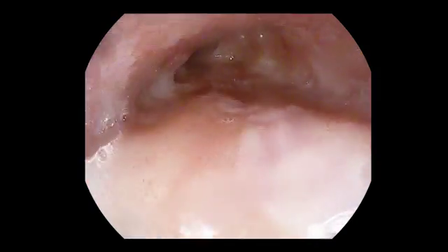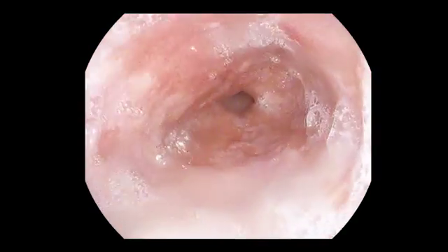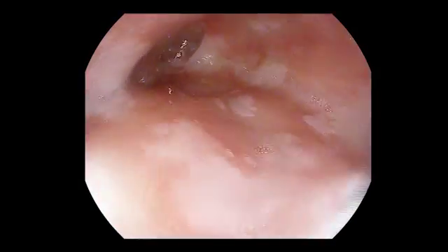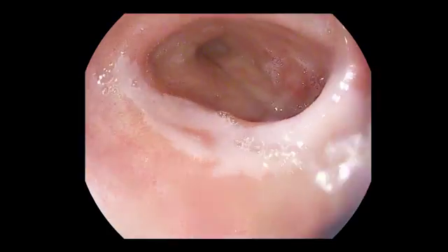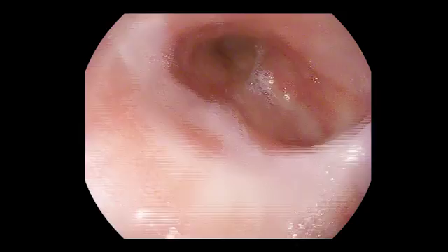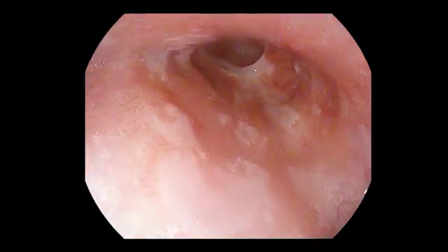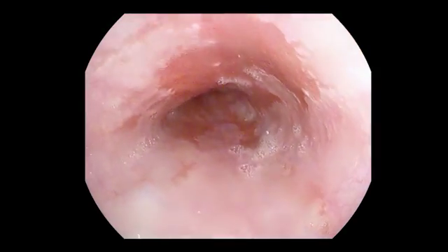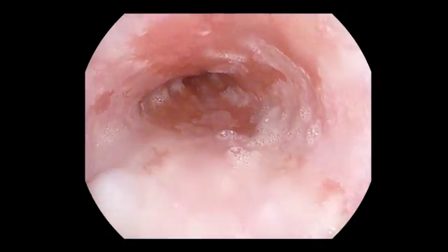Here we see the Barrett esophagus — it's quite a long Barrett, long segment, and this Barrett starts mainly here. This is the gastric fold. It's 40 centimeters, and here is the circular part. It's a C5, and here we have M9. So it's a C5-M9. This is quite a long Barrett esophagus.